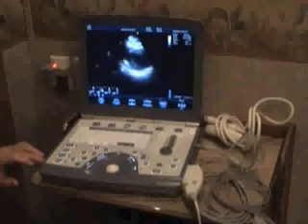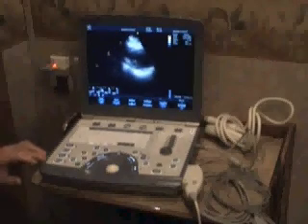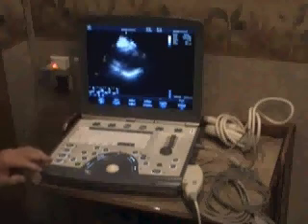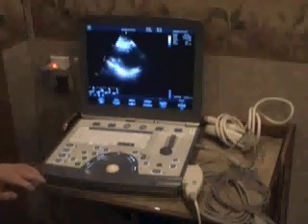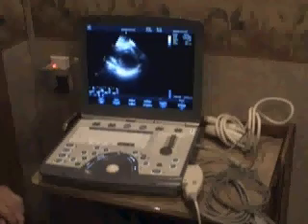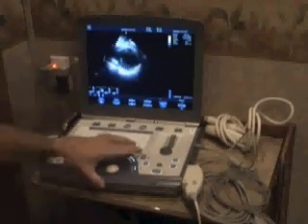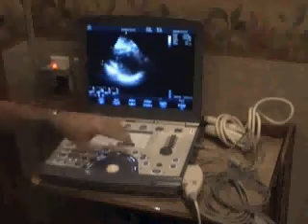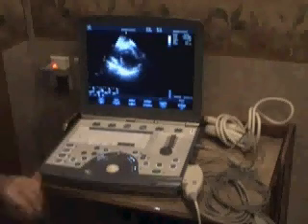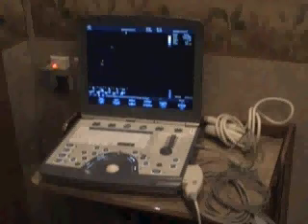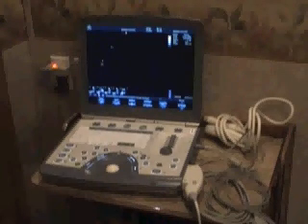As I said at the beginning of the video, I am not the best candidate, especially since I'm scanning myself sitting up. But you can see from this image that it gives you a pretty decent look at my left ventricle. And that is what we call the parasternal images that are typically taken during an echo.